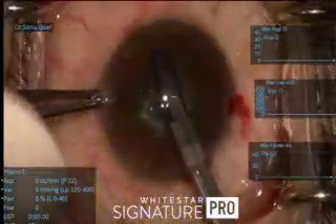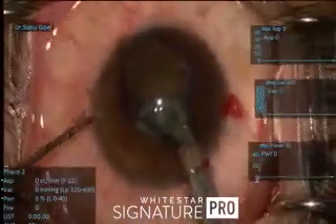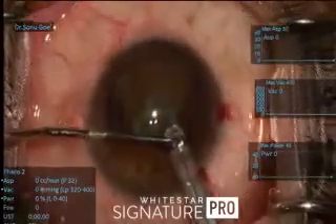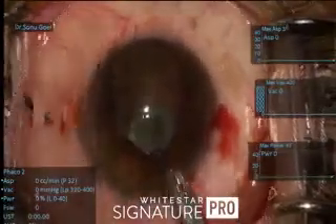This is how the Malyugin ring comes in and this is the delivery system. You have to be very careful — you have to use through the side port a Sinskey hook as a guide, and go underneath the pupillary margin either ways. Then the trailing end is very smartly taken in and gradually nudged at the pupillary margin. The pupil can then be centralized once the Malyugin ring goes and sits.